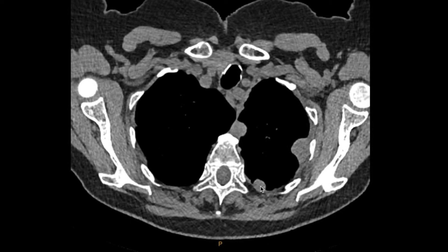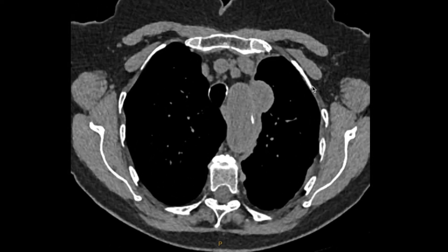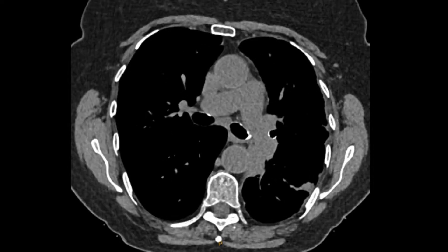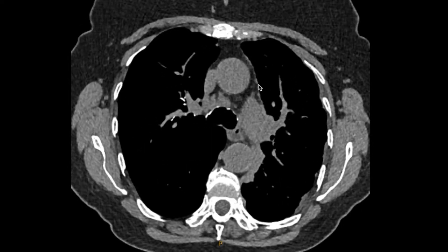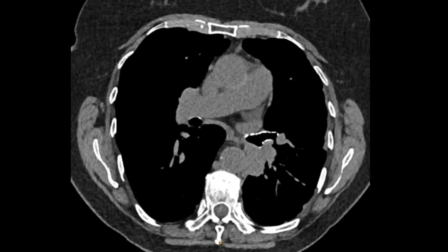Here are nodules that extend along the pleural surface. This is the aorta here, and you can see there's a lesion sitting right here on the mediastinal pleura. As we progress down we can see more thickening of this mediastinal pleura. And here — this is the descending aorta — but here's a nodule, probably another pleural nodule. This one is important because it's the one that's accessible bronchoscopically.